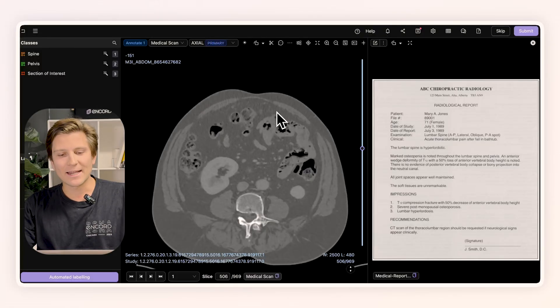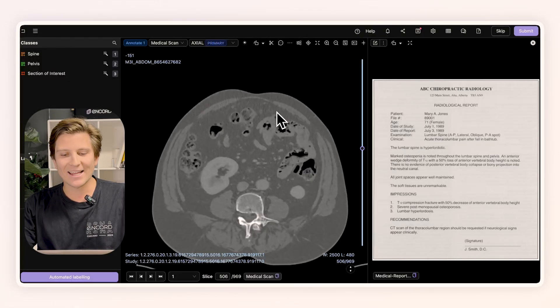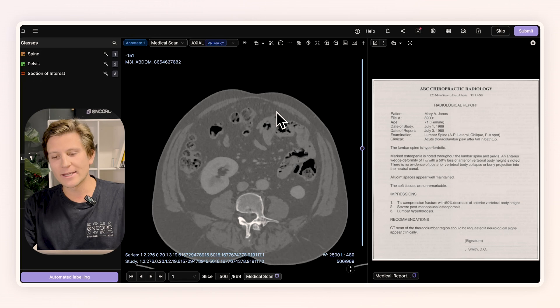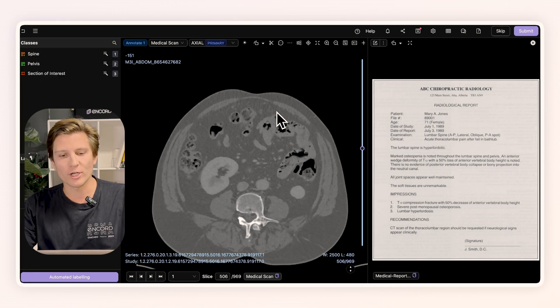Today, I'm going to show you how to annotate both a complex medical scan — a CT scan — alongside a PDF report of the operation.